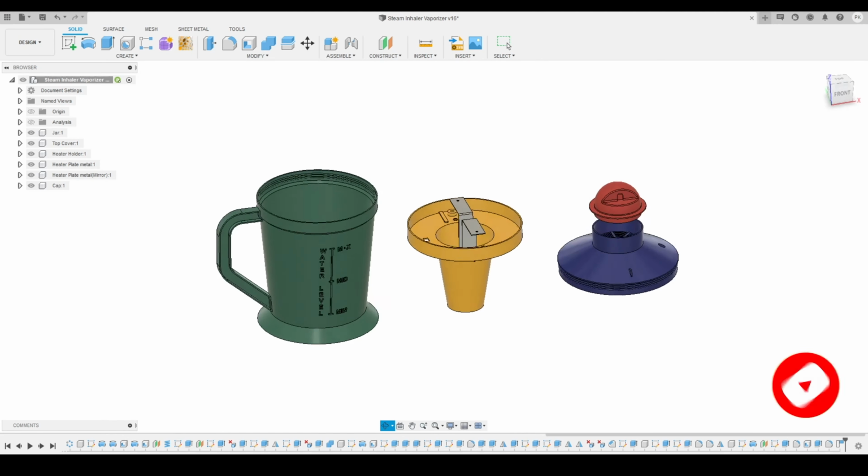Now I will revolve this bottom profile. I will activate the revolve tool and select this bottom profile, then activate the axis and select this vertical axis as the axis. Here you can see I will make sure that I change the operation to new body and press OK. So the bottom has also been converted to solid using the revolve tool, and we got two different bodies here, the top one and the bottom base.